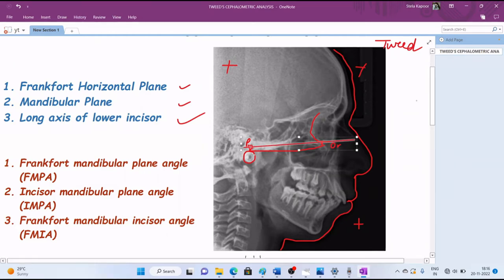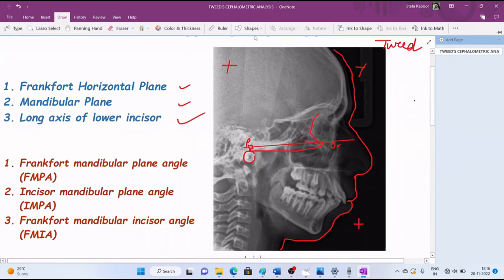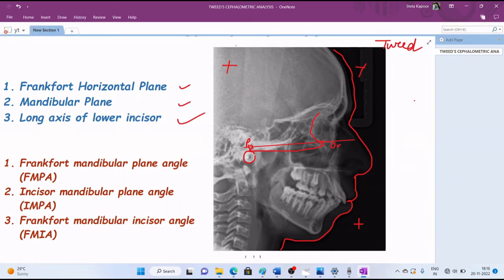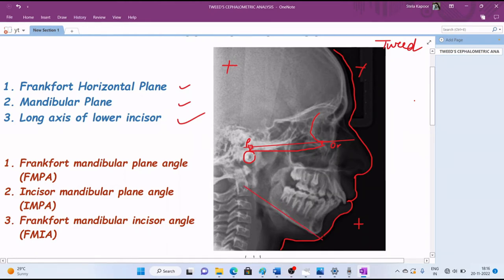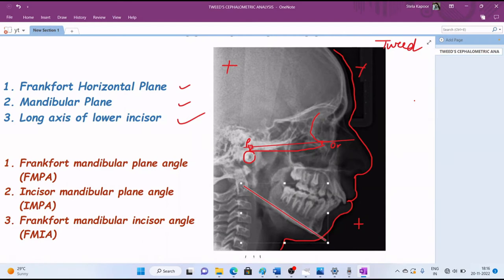Next is the mandibular plane. We know for a fact that different analyses use different mandibular planes. For Tweed, you can remember it by T and T. For Tweed, the tangent passing from the lower border of the mandible is considered the mandibular plane. This is our mandibular plane in Tweed's analysis.